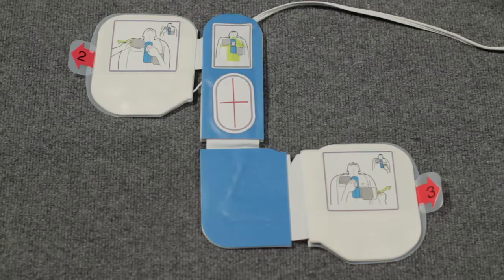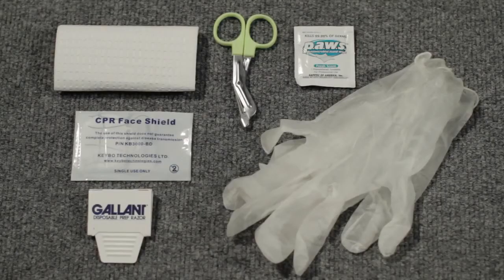The AED Plus has a one-piece electrode pad for analyzing the heart and delivering a shock, and a CPR landmark that allows the AED Plus to see your chest compressions and encourage you to perform CPR at the correct rate and depth. A rescue accessory package is attached to the electrode pads, which contains a barrier mask for giving rescue breaths, scissors for cutting clothing if necessary, a moist towelette for cleaning up, a razor for shaving chest hair, a paper towel for drying the victim's skin, and non-latex gloves to protect your hands.